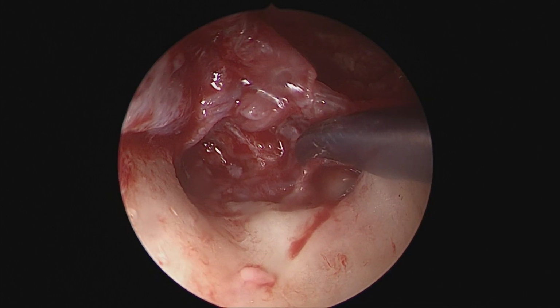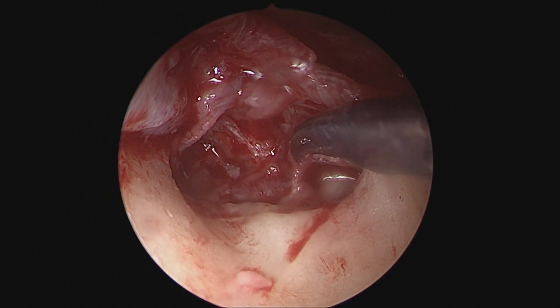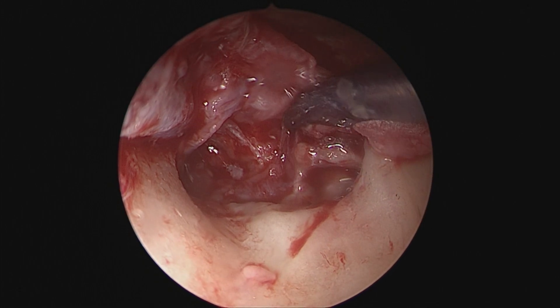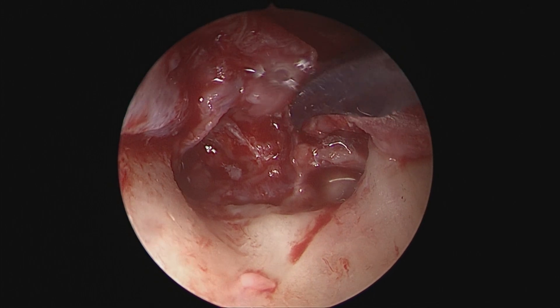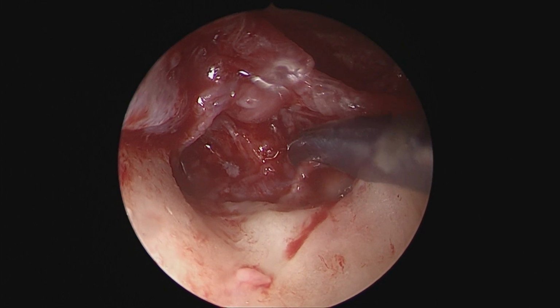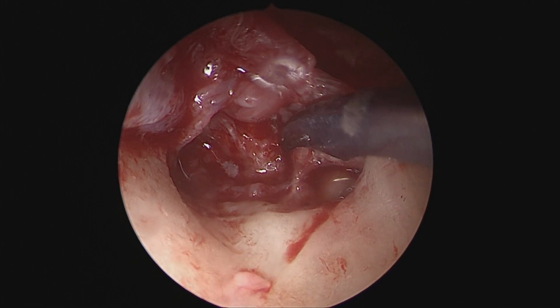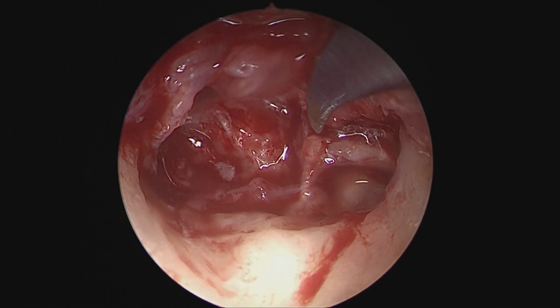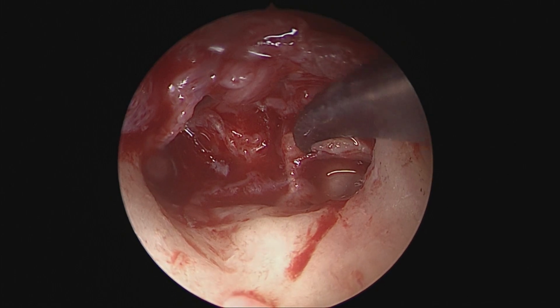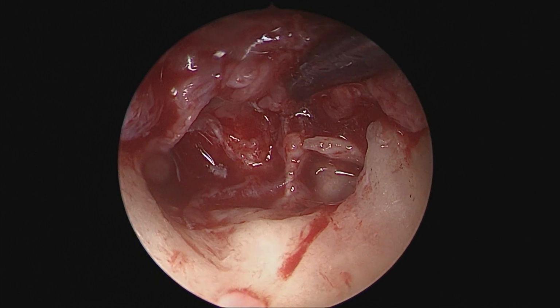Now comes the part of cleaning up of the stapes. In this patient, one has to understand that if we are very sure that there is no squamous epithelium, then we just need to have a gross debridement of the stapes and not to the extent that we rock the stapes too much. So we just use a sharp instrument like a sickle knife to gradually peel off the excess diseased mucosa from the stapedius tendon and the stapes head, trying to not cause excessive rocking movements of the footplate region. The eroded incus, of course, we'll remove.